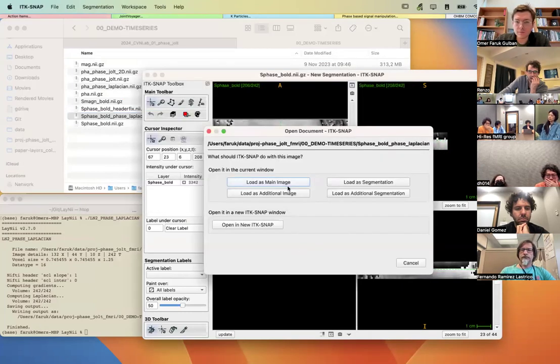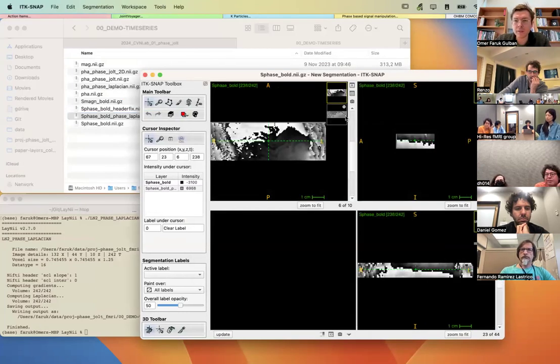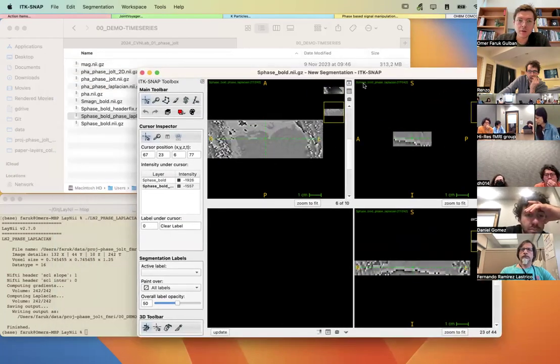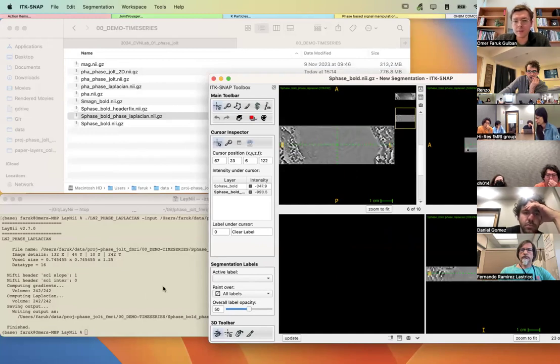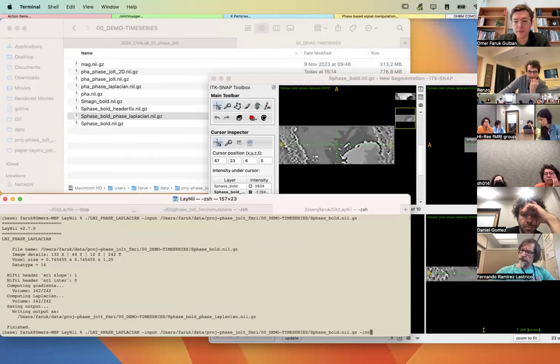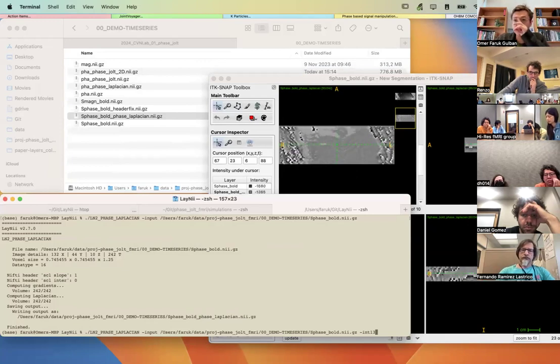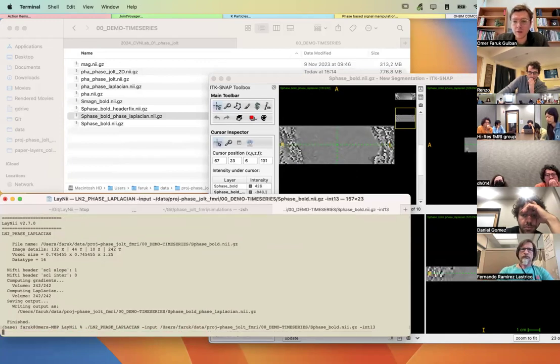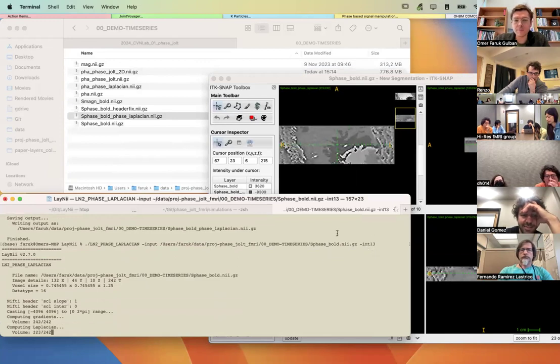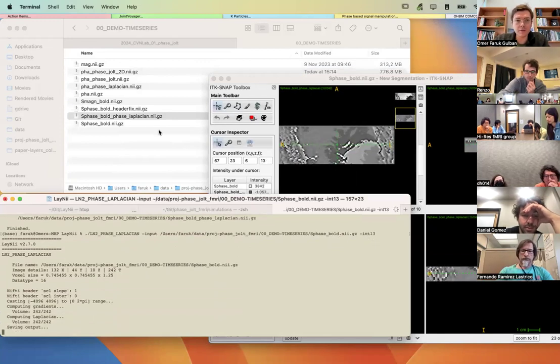It took like a couple of seconds because it's a small data set, but in the bigger whole brain ones, it will take a couple of minutes. This didn't compute correctly, and this was on purpose, because the initial data that comes from your scanners, if they are Siemens, is in the integer 13 range for some reason, but written as an integer 16 data precision. So you need to add this int 13 flag afterwards.